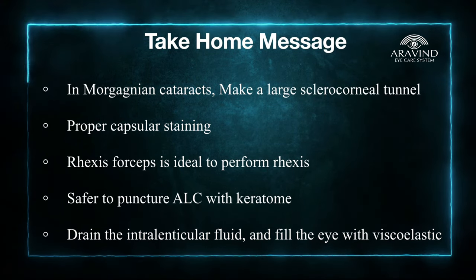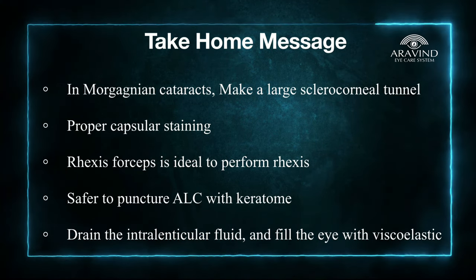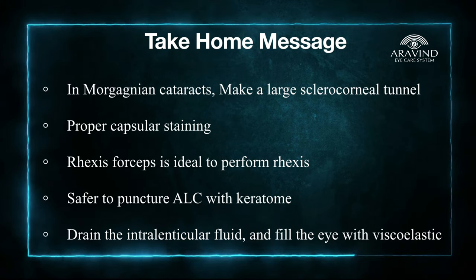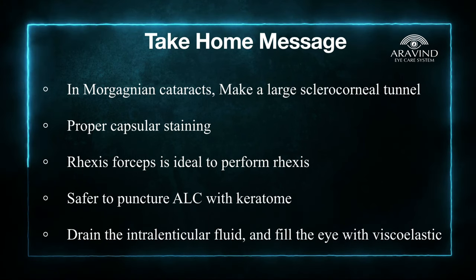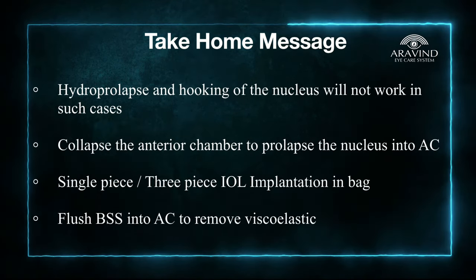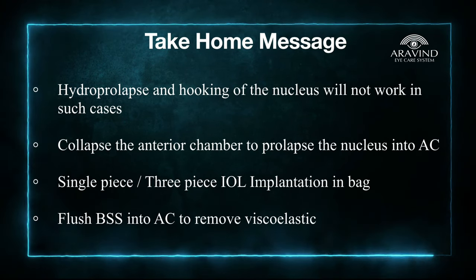The intralenticular pressure is neutralized slowly when you have a larger opening, but when you have a small nick with a cystitome, chances of Argentinian flag sign is high. Drain the intralenticular fluid completely and then fill the bag and anterior chamber with viscoelastic before initiating rhexis. Move the nucleus to the site where you are doing rhexis so that you have an underlying hard surface.